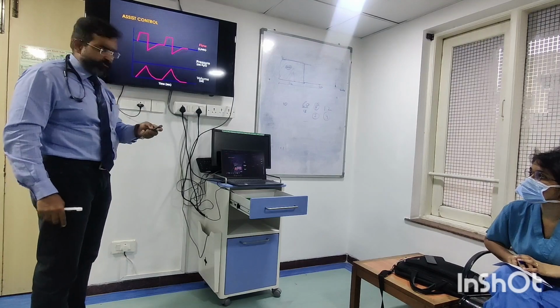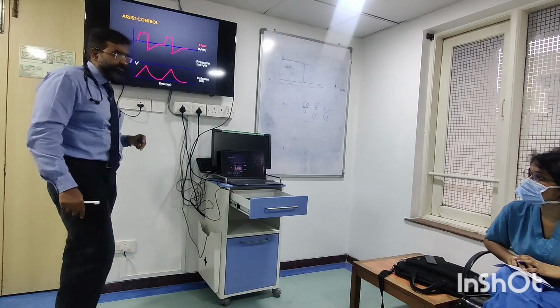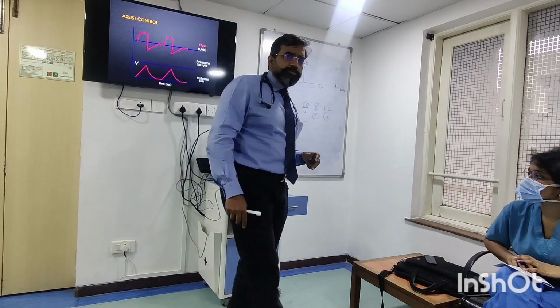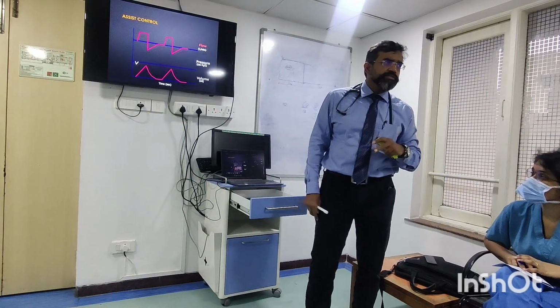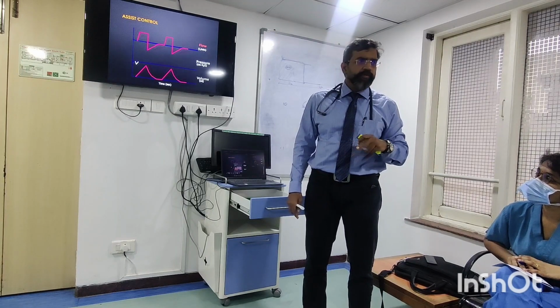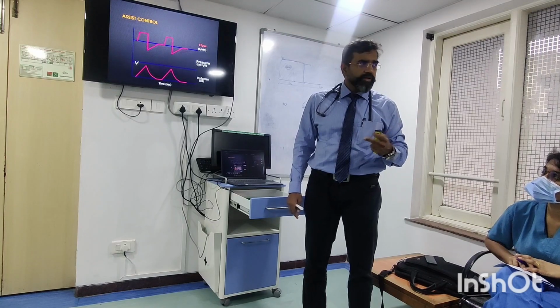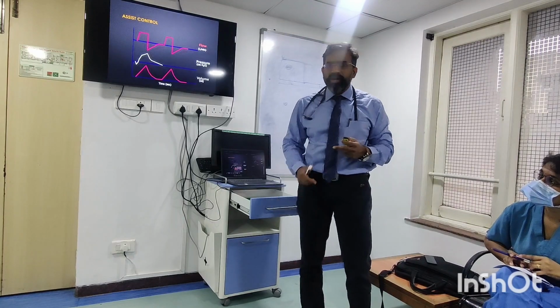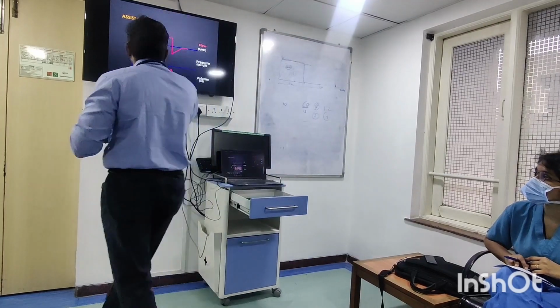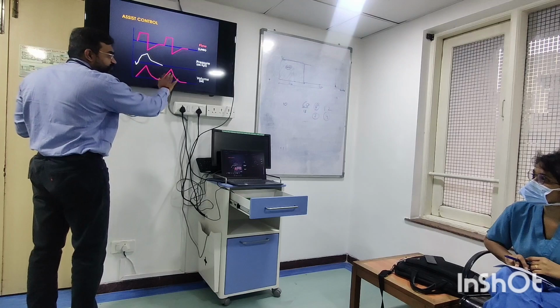Then if it is a pressure triggered breath and the patient is initiating, there would be a small deflection. So now what kind of trigger is this? This one is patient trigger. Forget about whether it is flow or pressure. This is patient trigger, and then you have variable pressures. You have one pressure here, one pressure here, one pressure here. So the pressure is varying.